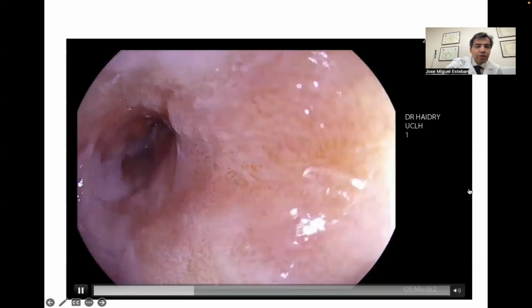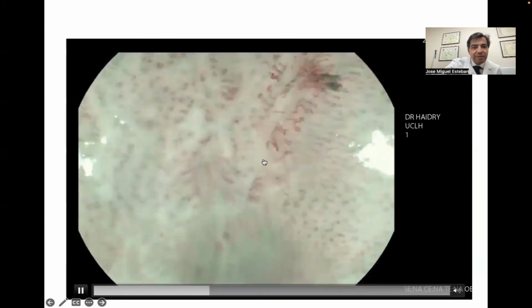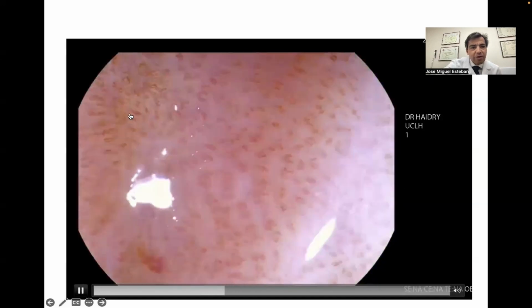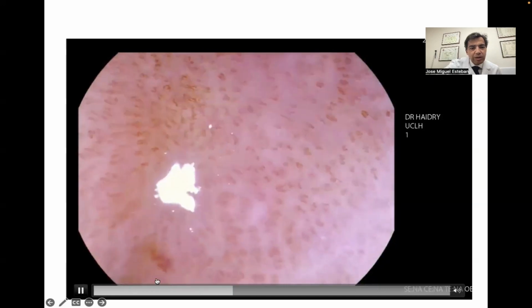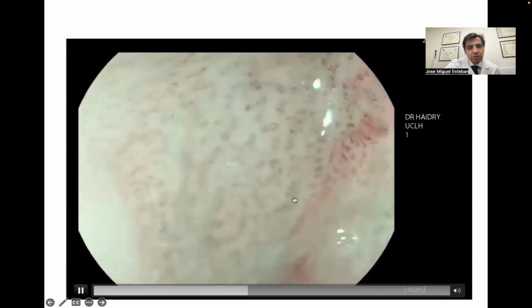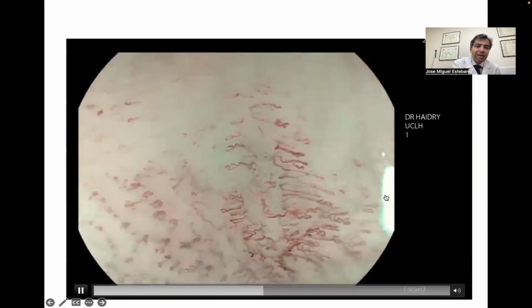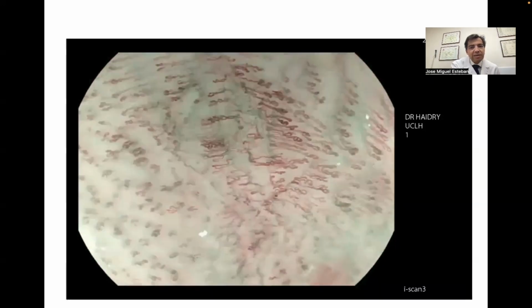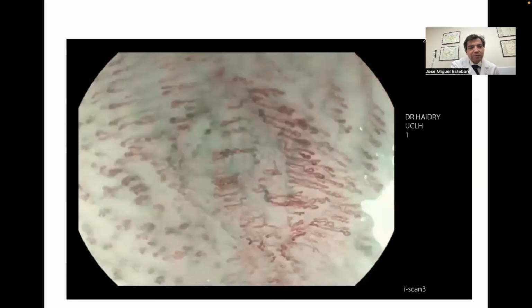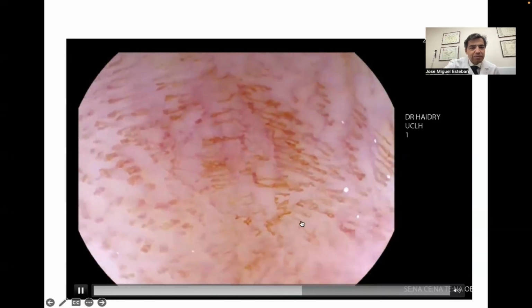We will see the loop formation of the B1, and there are some cases that with the loop formations, the IPCLs, the A, B1 are here, these ones, but you will start to see neovessels like here. So with the new neovessels, it will change the strategy, and maybe in this case it won't be treated because the chance of being SM3 will be higher. Here the vessels are just B1.